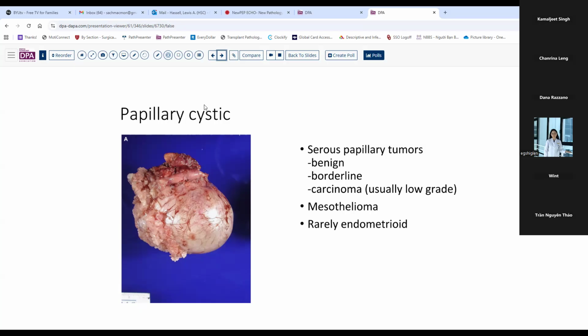By the way, Louis, those slides are beautiful for frozen section. Whoever's cutting your frozens, can we borrow them, please? Heavens, no, we're holding on to our histotechs as hard as we can. But yes, those frozen sections are almost as good as permanent. So kudos to your histotech there. I will pass the word along.